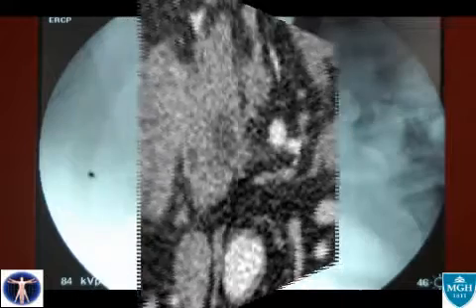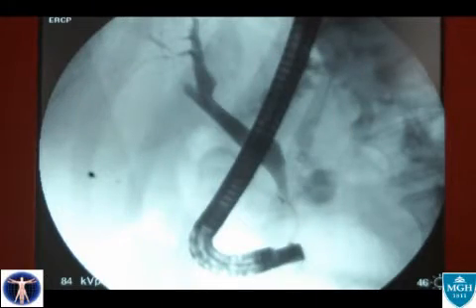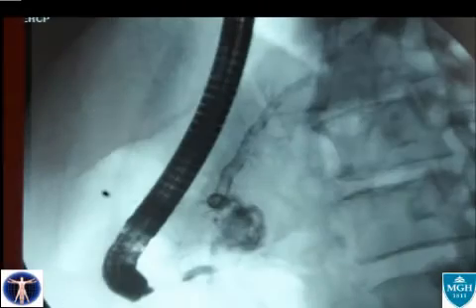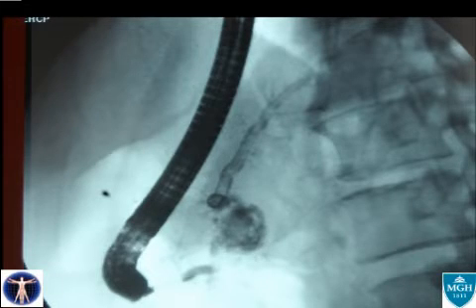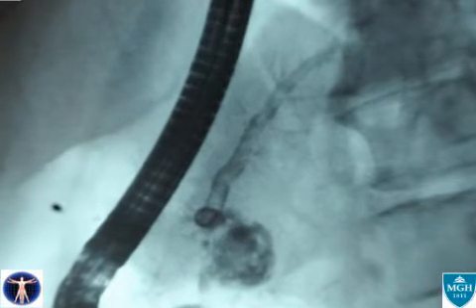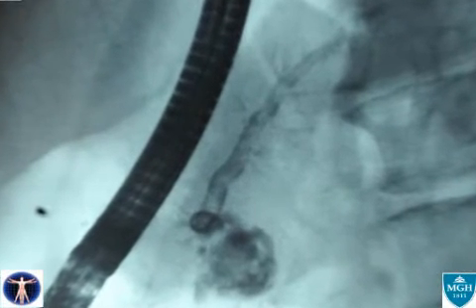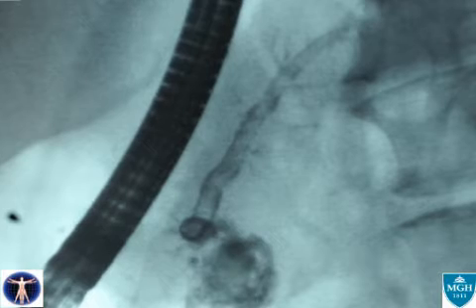The upper endoscopy was unremarkable, as well as the biliary tree seen here. The referring physician reported seeing fresh blood issuing from an opening adjacent to the main papilla. Injection here filled the pancreatic duct, revealing a cast within the duct and this cystic structure.